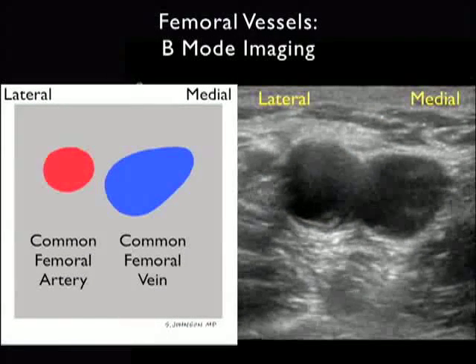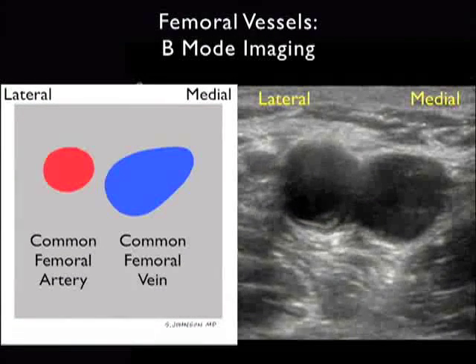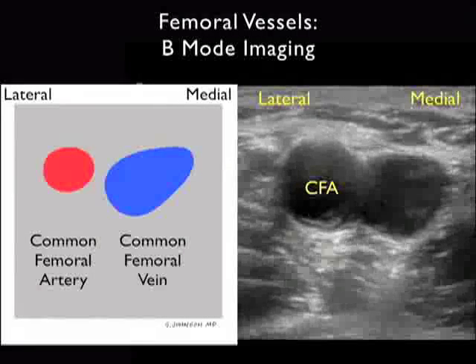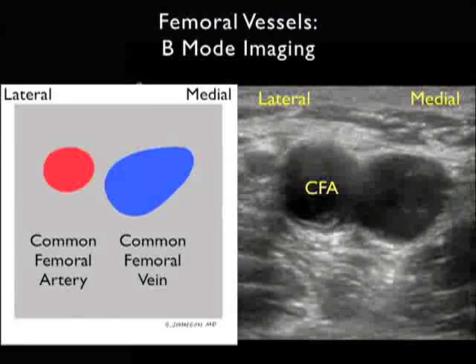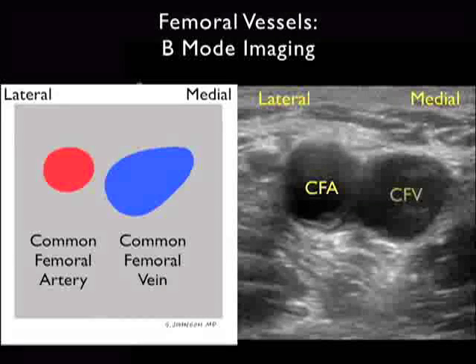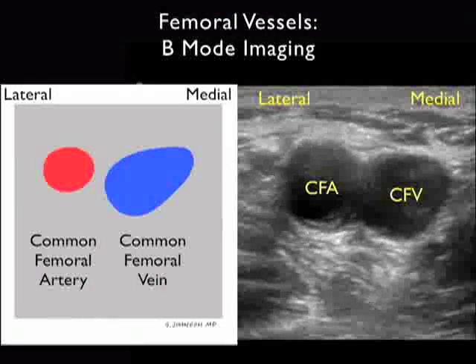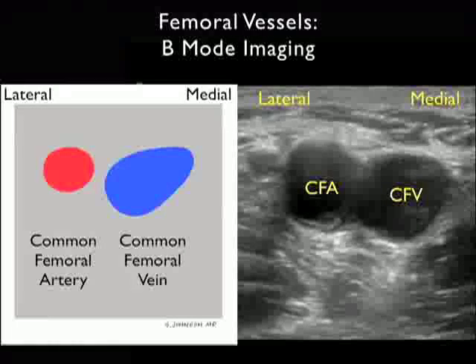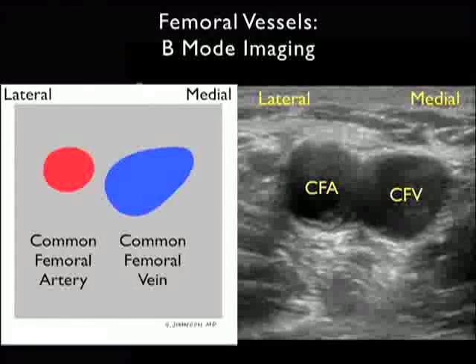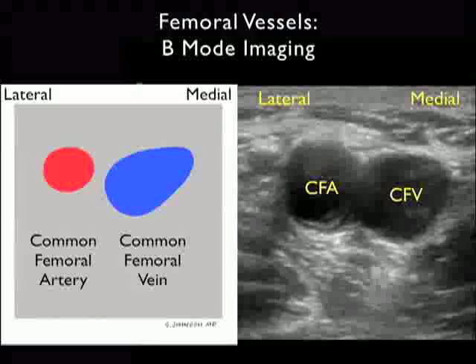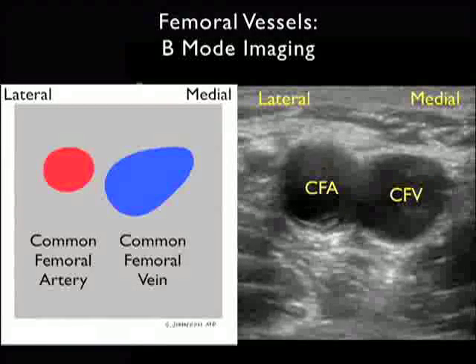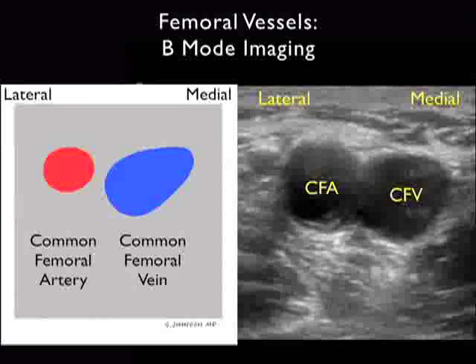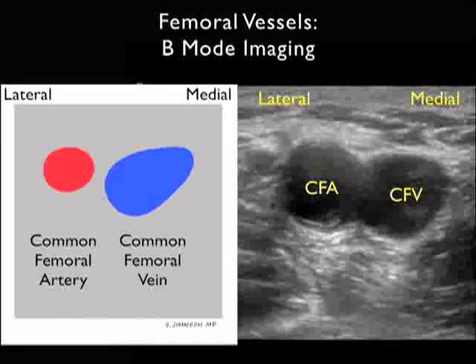While color flow Doppler is very helpful to differentiate the common femoral artery from the common femoral vein, we can also discern the two using grayscale or B-mode sonography. We note the common femoral artery lateral to the common femoral vein as seen medially. Notice that the common femoral artery has more hypertrophic walls and also pulsatile flow within it, differentiating it from the common femoral vein.